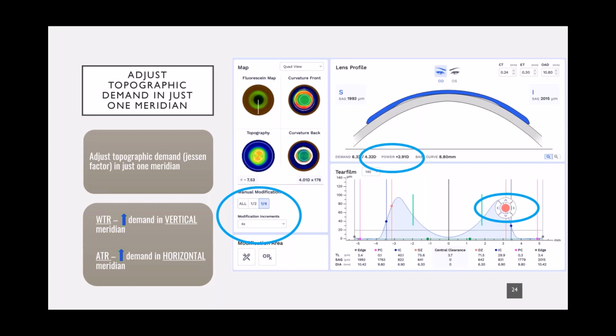So sometimes you need to go through more than one extra lens for some of those really hard fits. And that's why we charge more a lot of times on the tiered pricing that we do for really advanced fits and high cylinder and things like that, because we know we might have to make more lens changes.